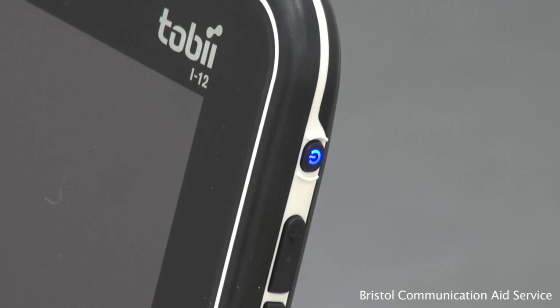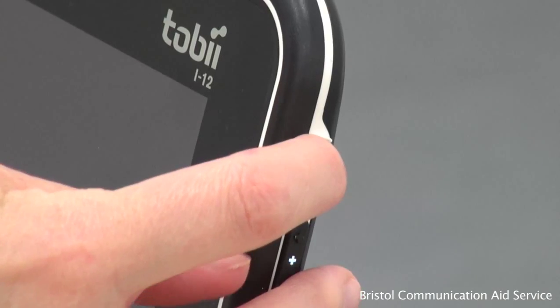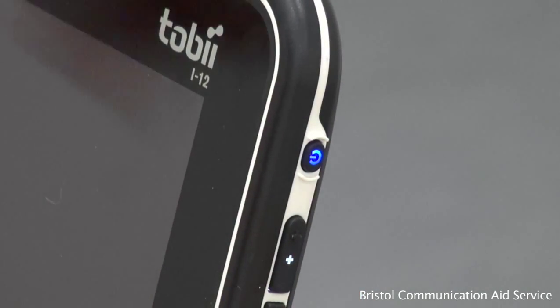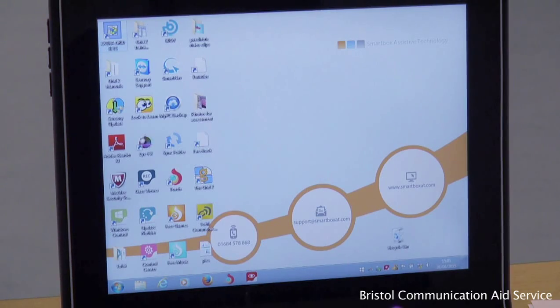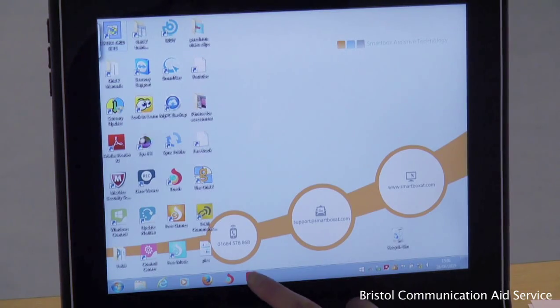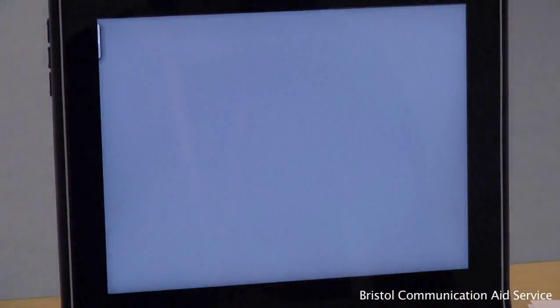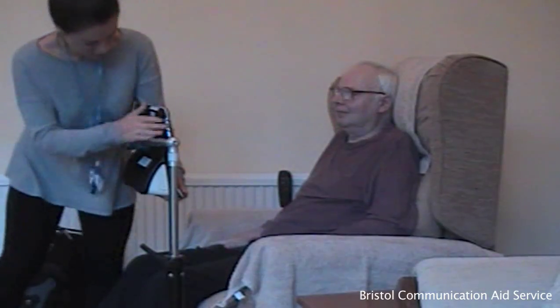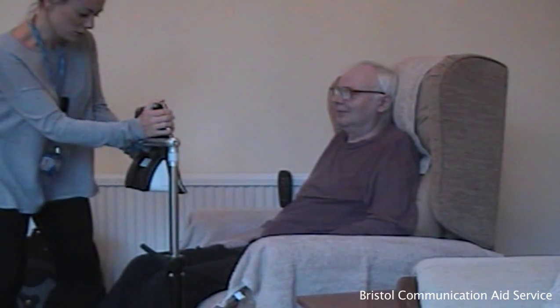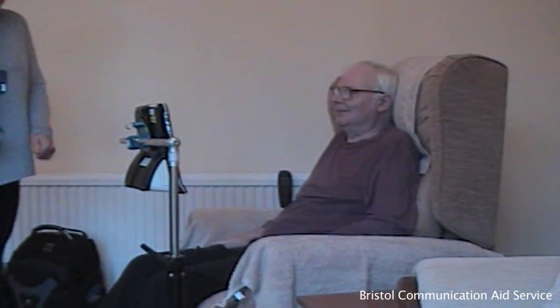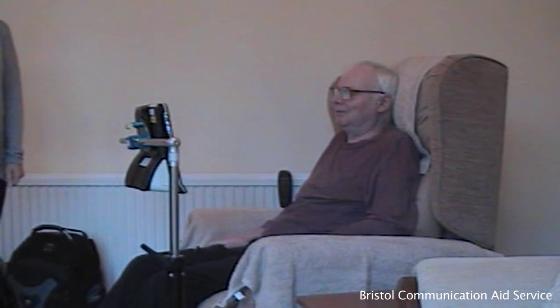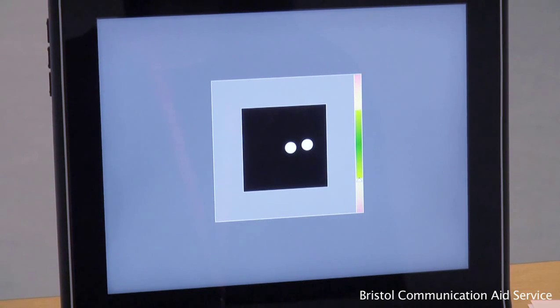To initiate your device, press the power button on the top right hand corner. Once open, select the eye gaze calibration icon and choose calibrate. To establish your position throughout use, be sure you are sitting comfortably while moving to centre the eyes so they sit in the green zone shown vertically. The program will still work if the eyes are situated within the red zone, however green is best.